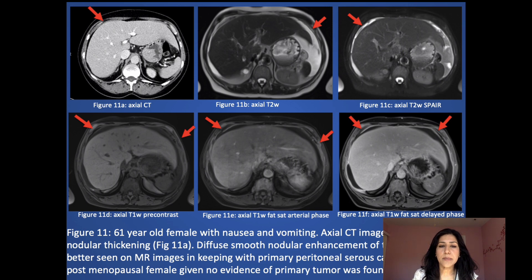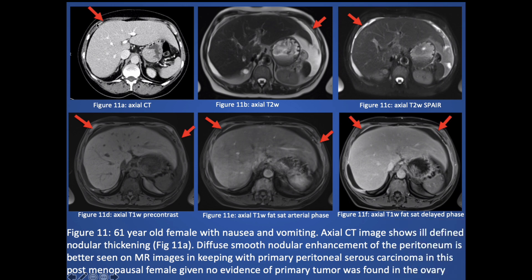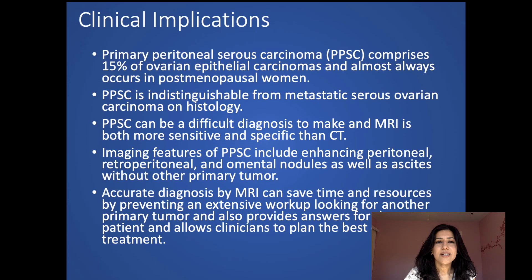This is a 61-year-old female — as you notice, all these patients are postmenopausal. The axial CT shows ill-defined nodular thickening, which is better characterized on the MR images. There is diffuse smooth nodular enhancement on the post-contrast images, consistent with primary peritoneal serous carcinoma, given no evidence of primary tumor in the ovaries.